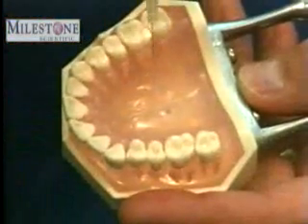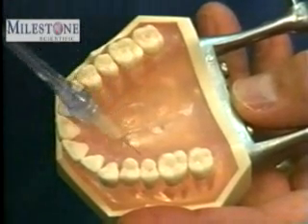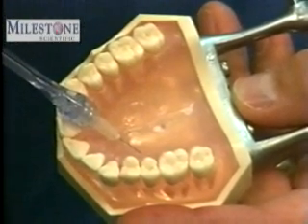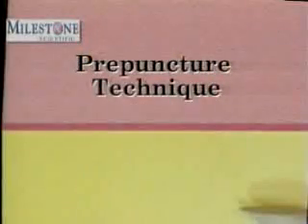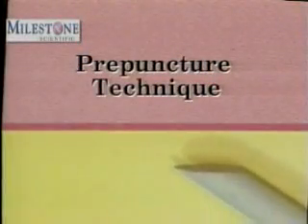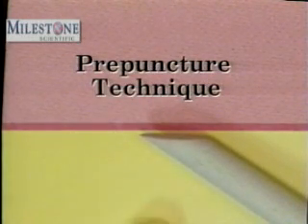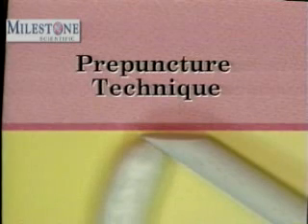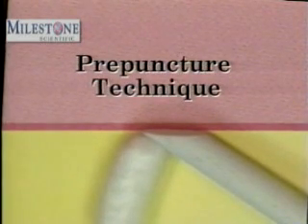The injection should not be approached perpendicular to the palate, but rather at a 45-degree angle with the palatal tissue to ensure the bevel is parallel with the palate. Initiate the pre-puncture technique by gently placing the bevel against the palatal tissue, but do not puncture the tissue at this time. Apply pressure on the back of the bevel with a sterile Q-tip swab to maintain a seal.